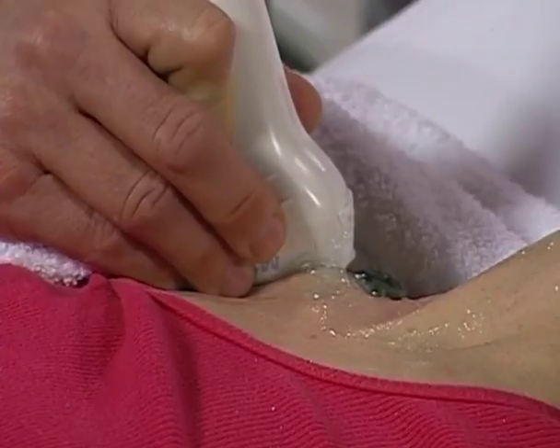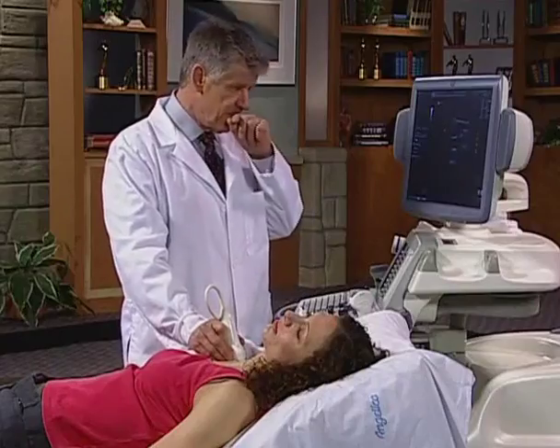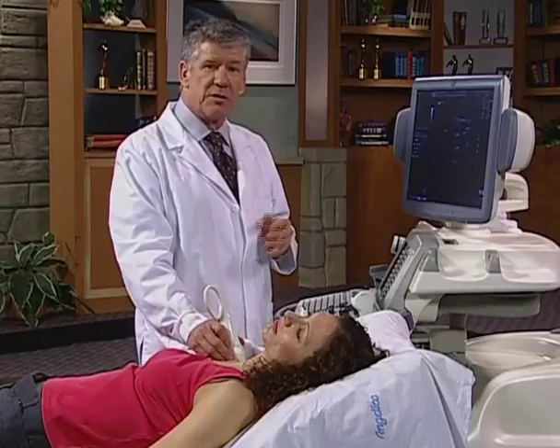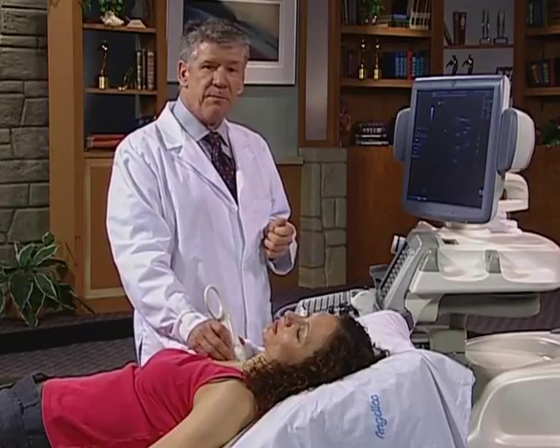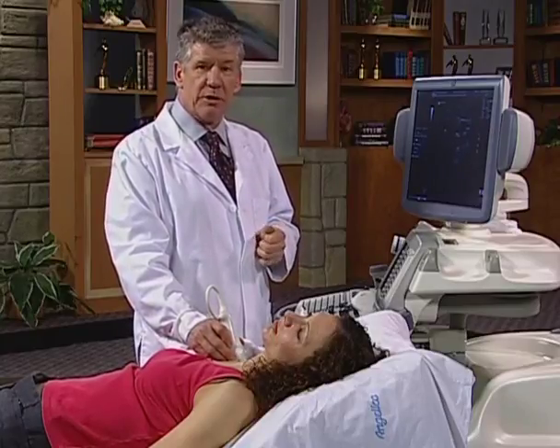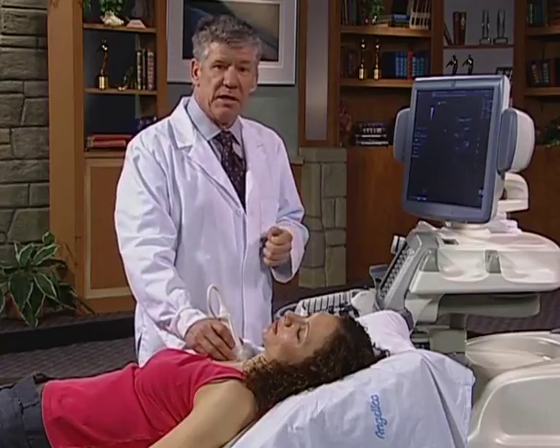As I turn the transducer here, I'd like to mention the orientation on the screen. When we start out on the common carotid artery, it's typical to have the thyroid to the right of the screen, typical of a carotid evaluation. As we scan down into the proximal portion of the innominate artery, the innominate will be to the right and the subclavian to the left.